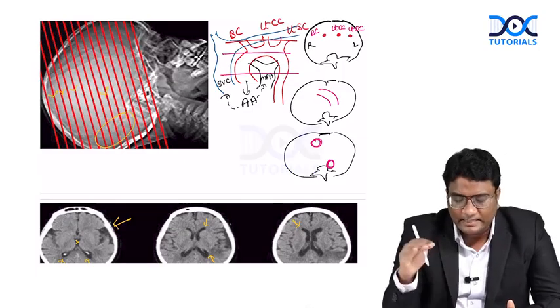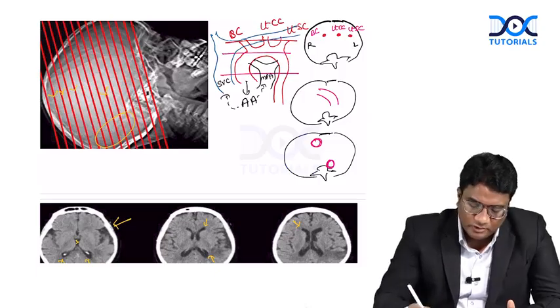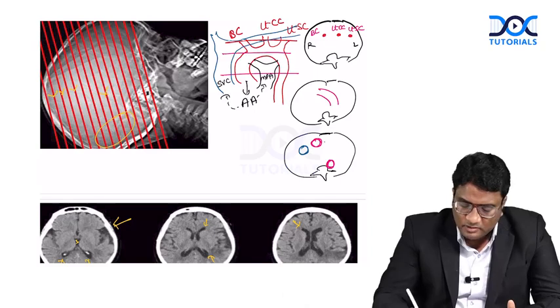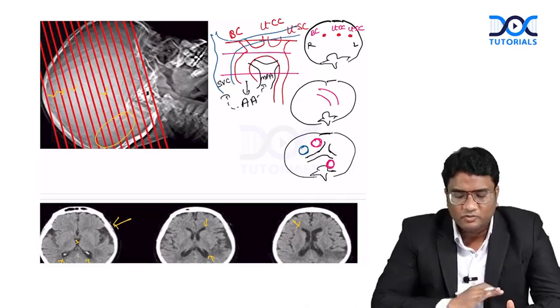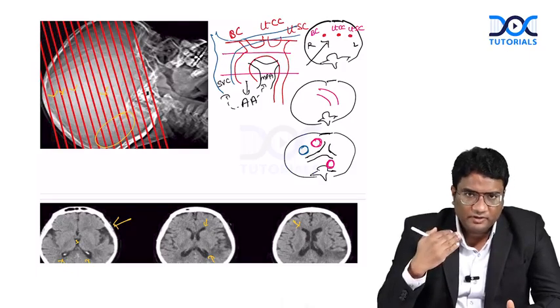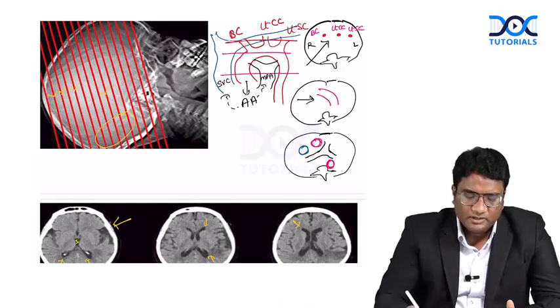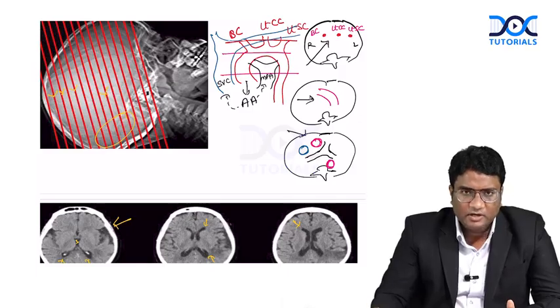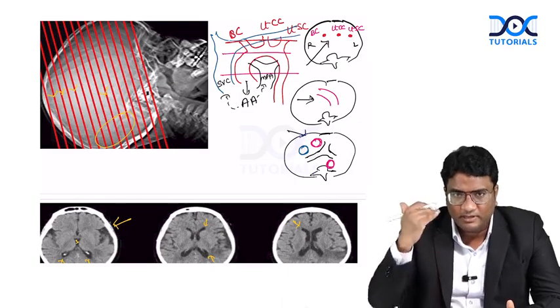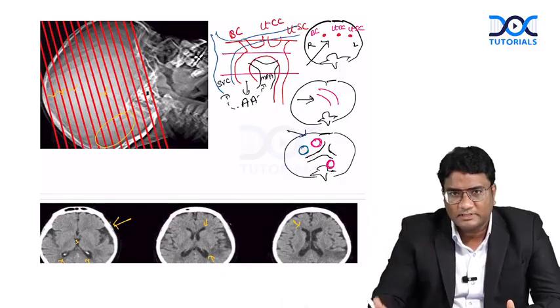So if you take a section there, towards the right, you will see the superior vena cava. Towards the left, you will see the main pulmonary artery dividing into right and left branches. So this is how the sections will appear. So initially you will see the branching of the arch of aorta. Then you will see the arch of aorta. Then you will see the ascending and the descending aorta. Don't expect to see everything in every slice. Okay, please understand where you are in the body, and that is how the images will start appearing.